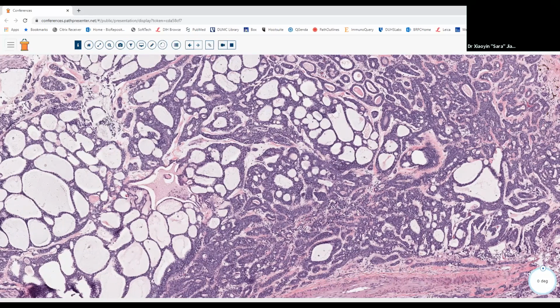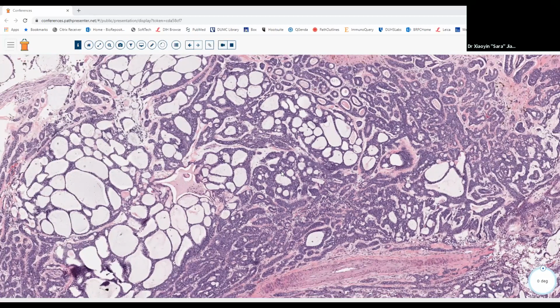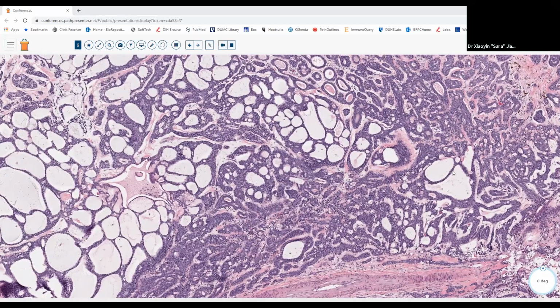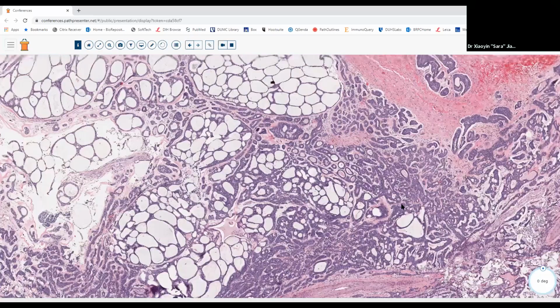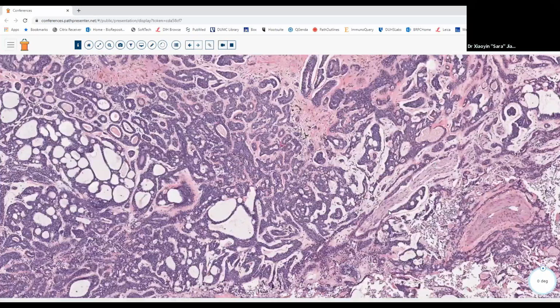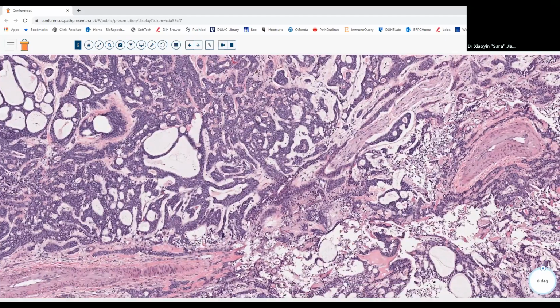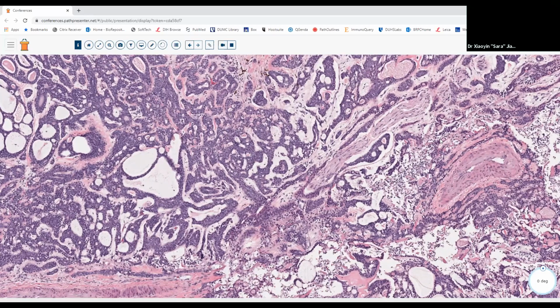So all of this is describing, of course, adenoid cystic carcinoma. So another very common tumor that we see in the salivary gland. Parotid is the most common site, but you can get these in minor salivary gland sites as well. And perineural invasion is very, very characteristic of this tumor. So I definitely want to see it in these adenoid cystics. It's very, very characteristic.